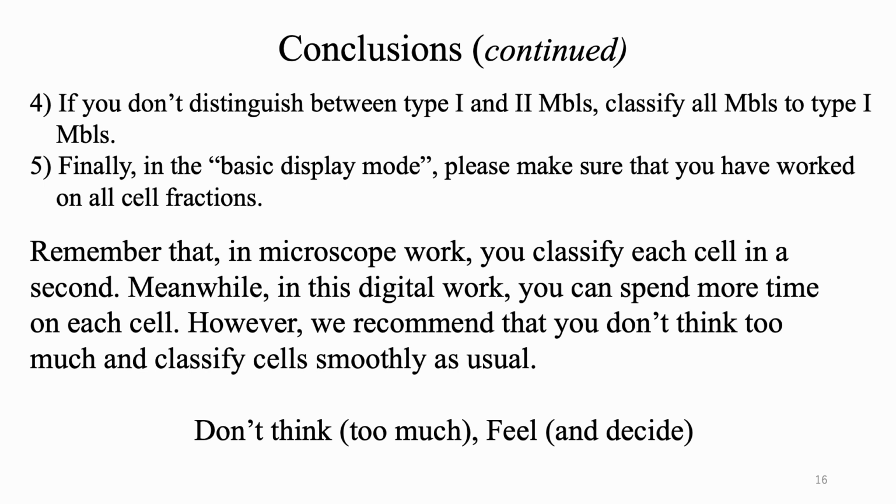Finally, in the basic display mode, please make sure that you have worked on all cell fractions. Remember that in microscope work, you classify each cell in a second. Meanwhile, in this digital work, you can spend more time on each cell. However, we recommend that you don't think too much and classify cells smoothly as usual.